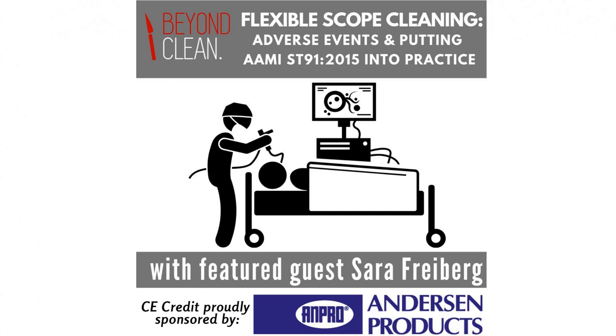Let me chime in on too much enzymatic. I think it's just you don't see the fill line everywhere you go. They don't necessarily have an automatic dispenser to do the right proportioning of the enzymatic to the water. A lot of times people just think more is better. And if they have just the detergent sitting in the bottle alongside the sink with the pump, they just start pumping and pumping and pumping.